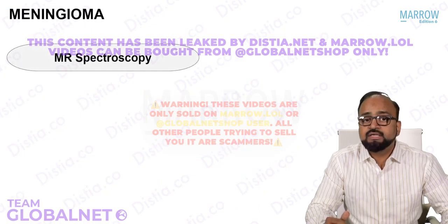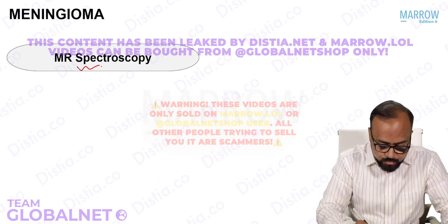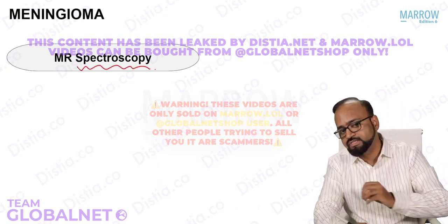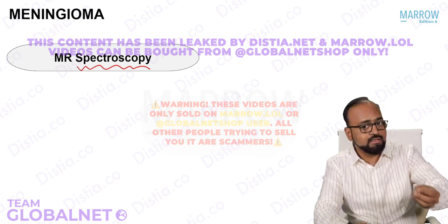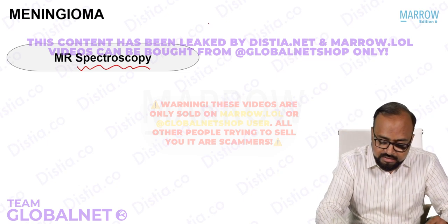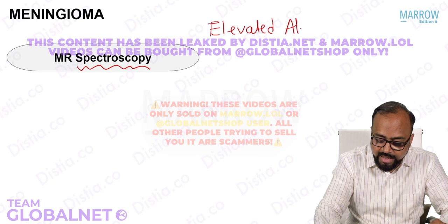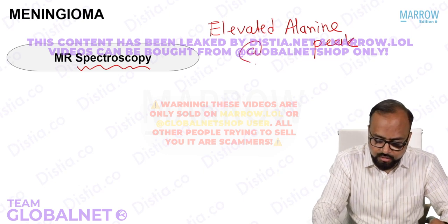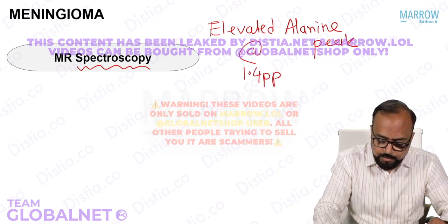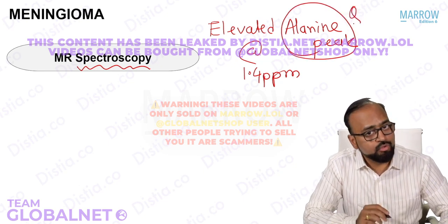Now, meningioma is also associated with a specific finding on MR spectroscopy. What is MR spectroscopy? It gives us the chemical composition at a particular site, and meningioma therefore gives rise to a specific chemical peak at that particular site, and this is an elevated alanine peak, which is seen in MR spectroscopy at 1.4 ppm, right? So this is an elevated alanine peak, which is very, very important. I want you to know about meningioma.